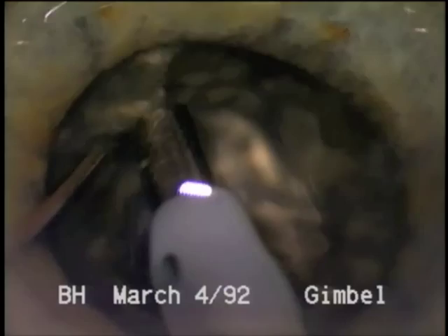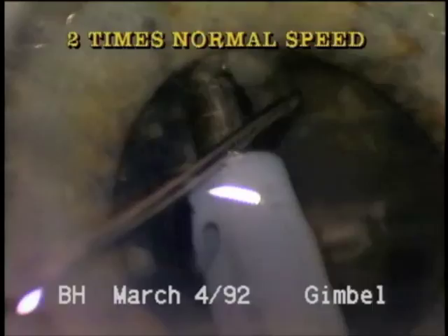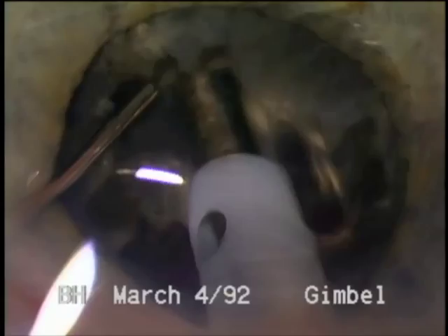Notice the high magnification used in this case — the higher the magnification, the greater the stereoscopic separation. Without a pink fundus reflex, it is also helpful to dim the room lights and to use high illumination on the surgical microscope.